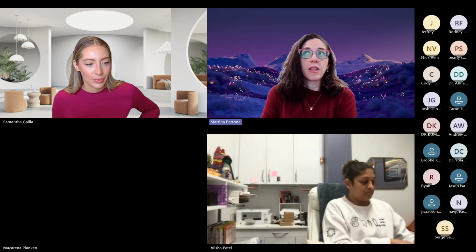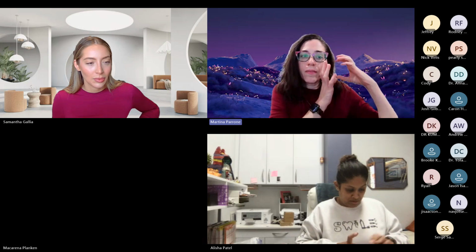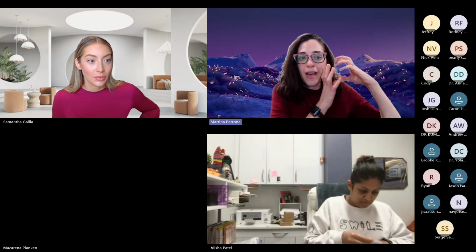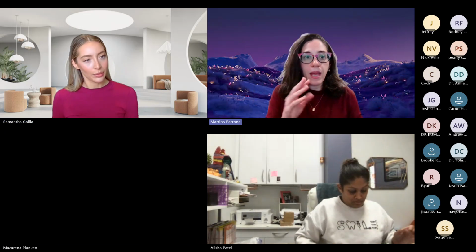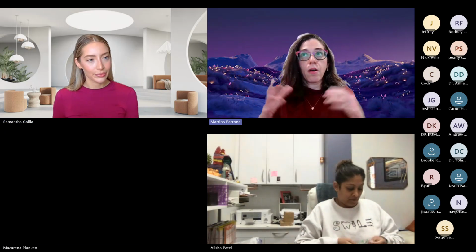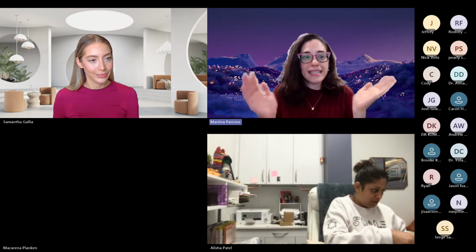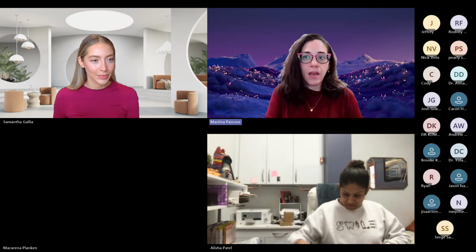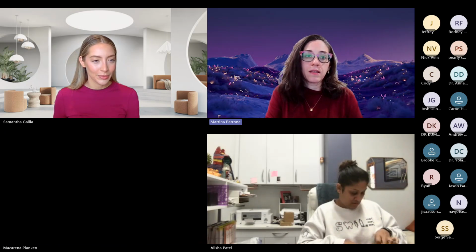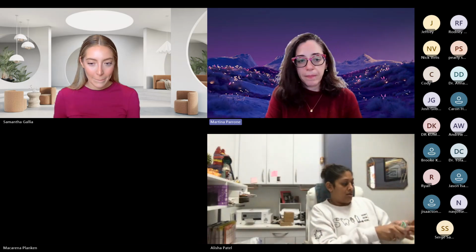And you do have the option, if your machine doesn't do that, to do very small volumes. We have one school that does 5x5s on each TMJ, and then they take a pano. They do the pano because the TMJ is a growth center for the rest of the mandible, and so it helps us see what happened as that patient was developing, and whether that TMD has been going on since they were growing or if it happened post growth.